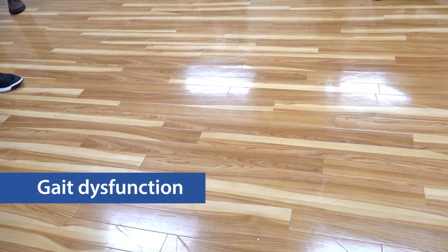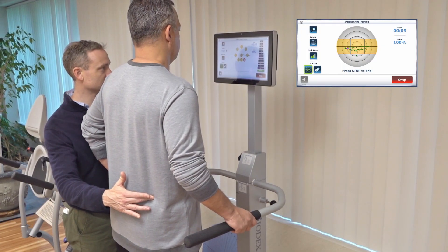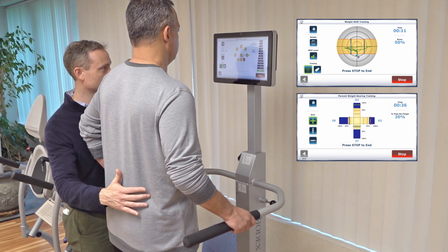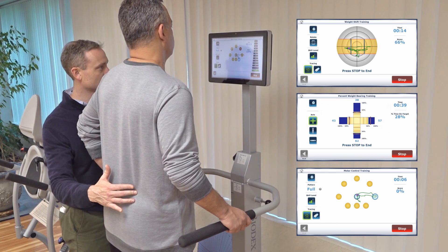Patients may experience decreased weight shifting and weight bearing, which can affect their gait. It's important to work on bilateral symmetry. Along with weight shifting and weight bearing modes, motor control training can help achieve the goal of bilateral lower extremity symmetry and motor initiation.